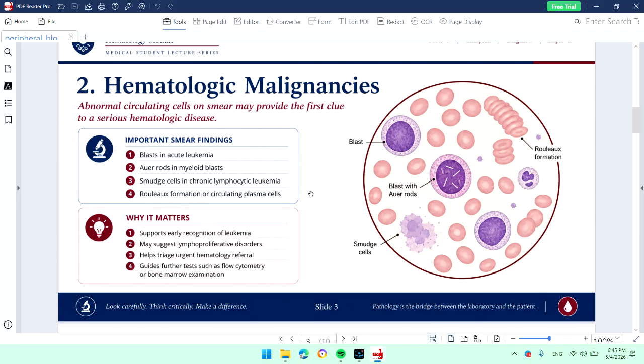During leukemic involvement, for example, acute myeloblastic leukemia or acute lymphoblastic leukemia, blast cells are found in tremendous numbers in peripheral blood, and it is the first step in diagnosing leukemic involvement. You know that it should then be confirmed by bone marrow aspiration or bone marrow biopsy.